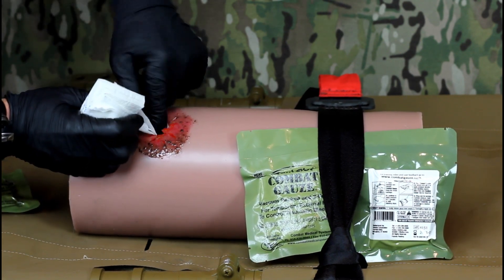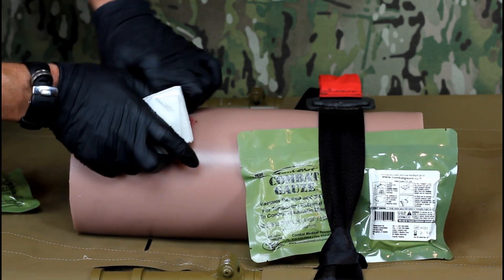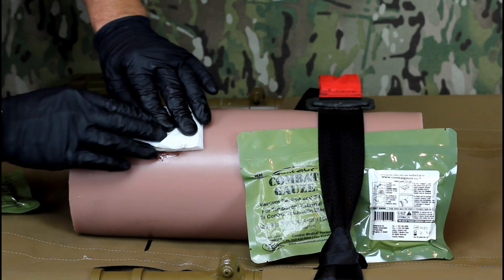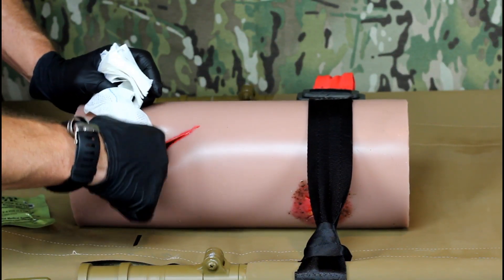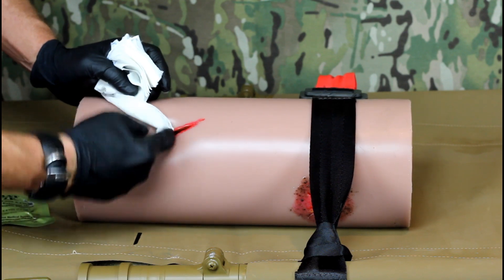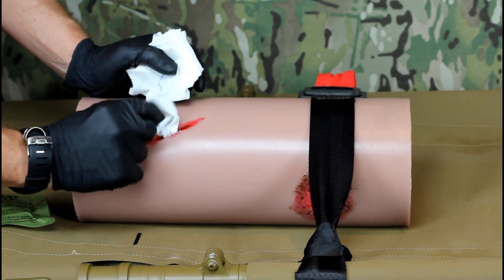Pack the wound completely and fully, including filling any gaps or channels away from the main wound. A wound may not always present as a round hole. Regardless of the wound's size or shape, you must fill it completely with combat gauze.